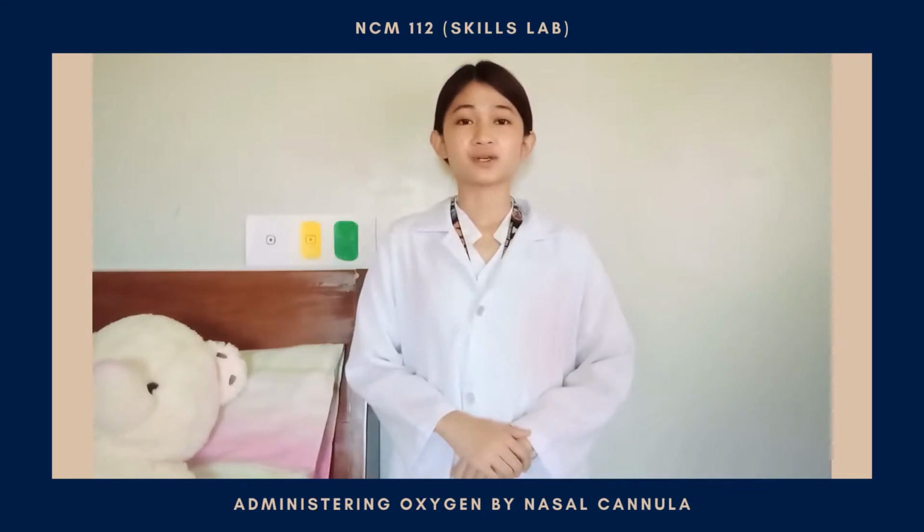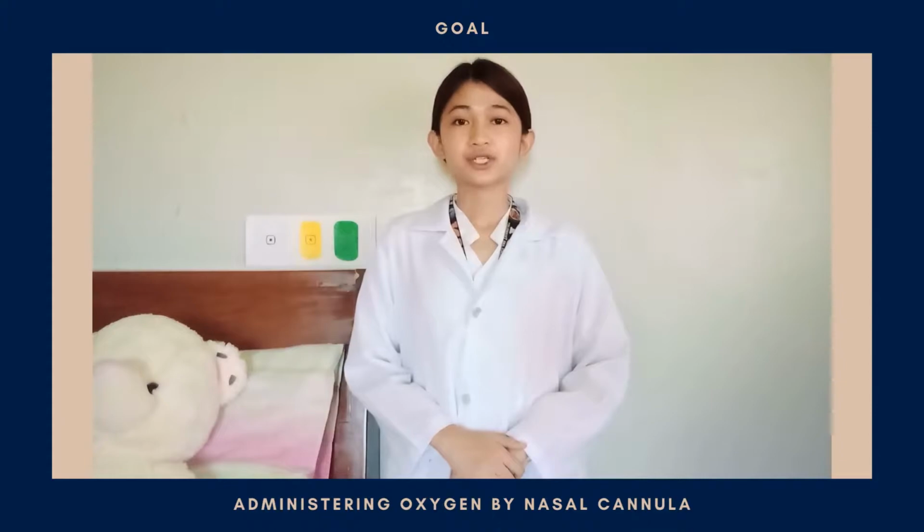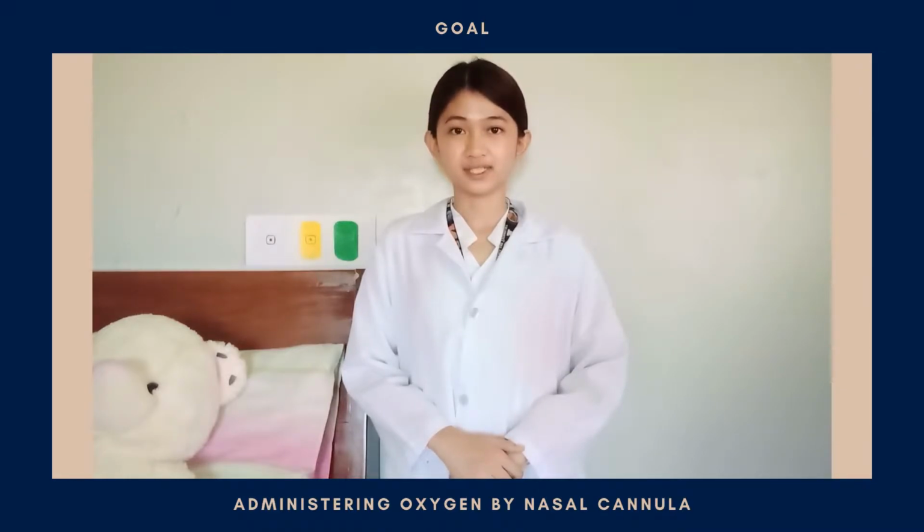Good day, I'm Hanz Nicole from BSN-3D, and today I will be demonstrating how to administer oxygen by nasal cannula, and the goal of this procedure is for the patient to exhibit an oxygen saturation level within acceptable parameters.